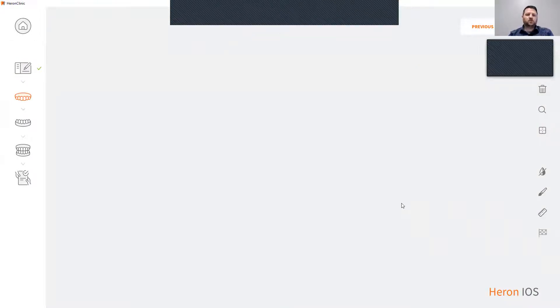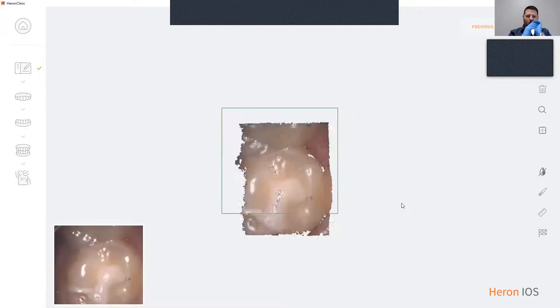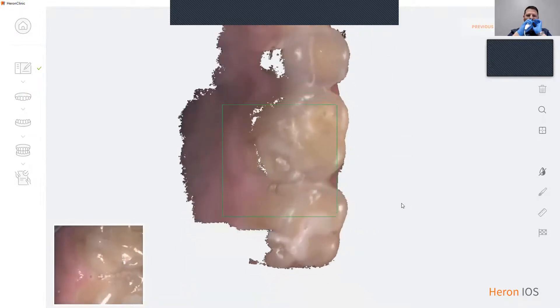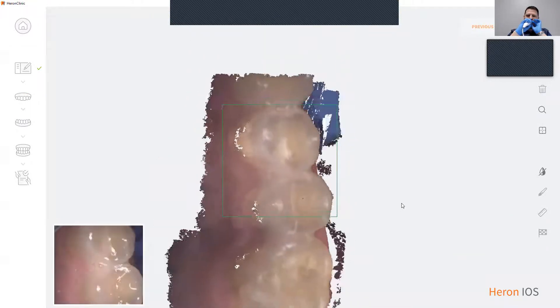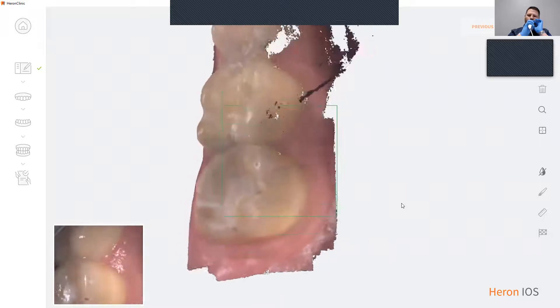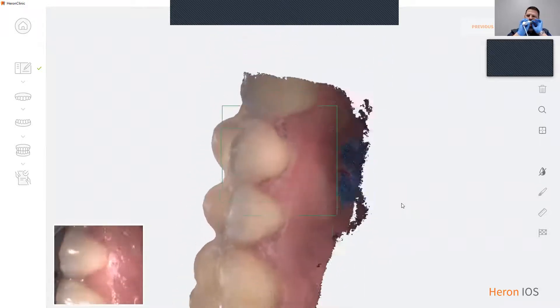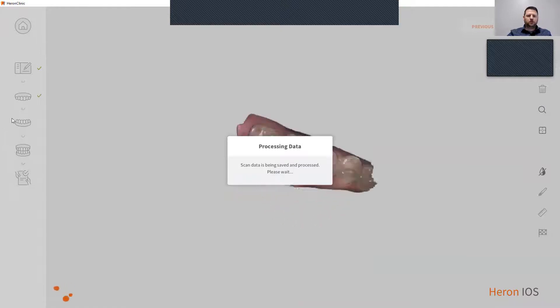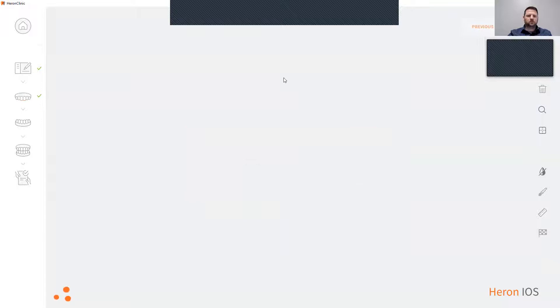This then brings you to the scan software. I'm going to be scanning an arch in my mouth so you can see what the scanner looks like. To go to the lower arch, I will click next. This will take you to the lower.